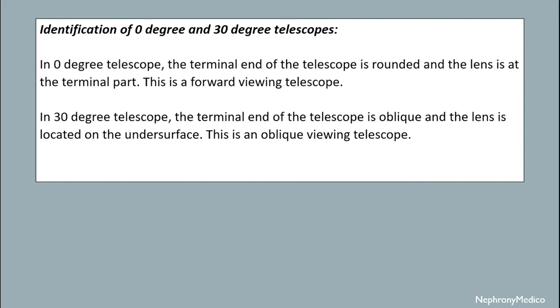Identification of 0 degree and 30 degree telescopes. In the 0 degree telescope, the terminal end is rounded and the lens is at the terminal part — this is a forward viewing telescope. In the 30 degree telescope, the terminal end is oblique and the lens is located on the under surface — this is an oblique viewing telescope.